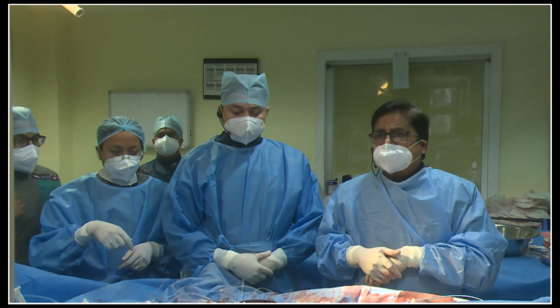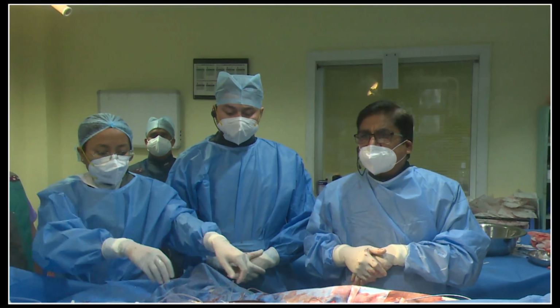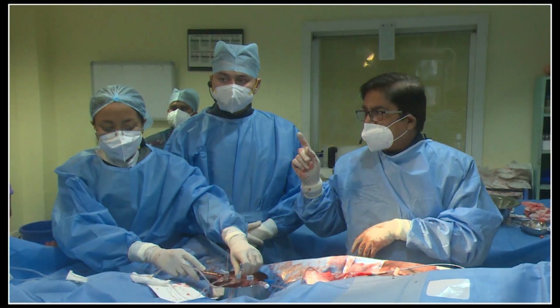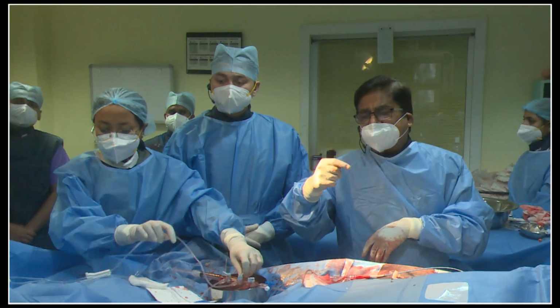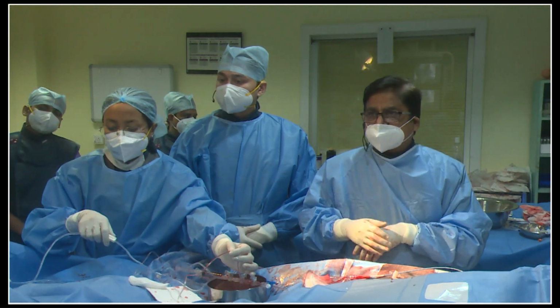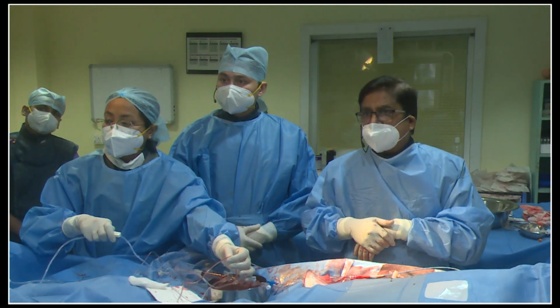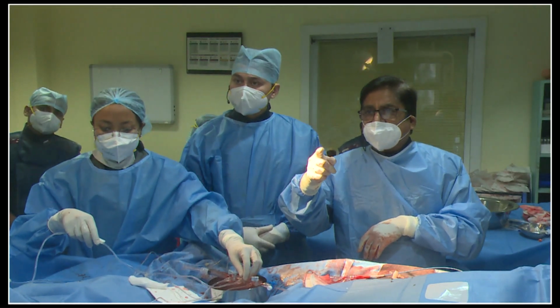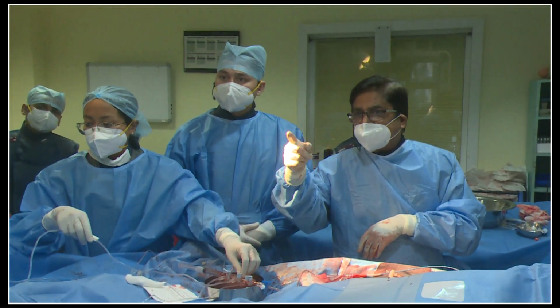Okay, so now can you show me the first angio that you showed of the right coronary, because it was patent till the RV branch, but now it is not patent till the RV branch also. The occlusion was beyond the RV branch. Here if you see the angio, so the RV branch is coming in between.